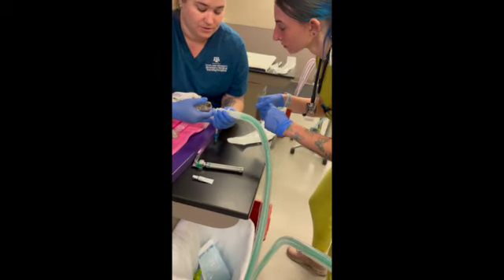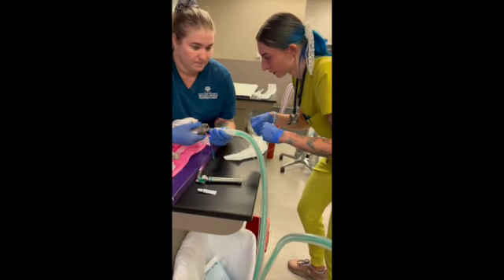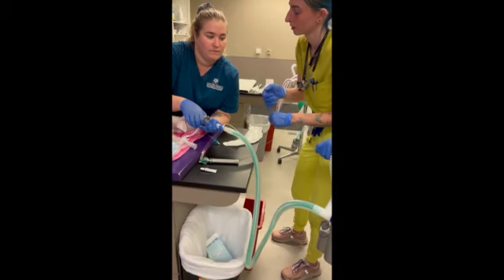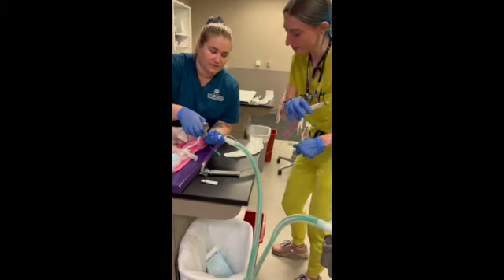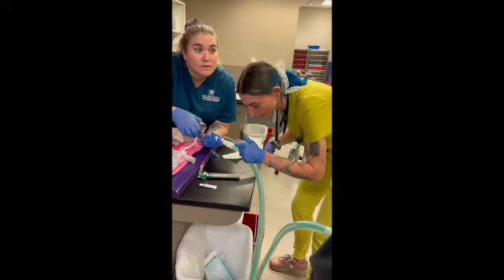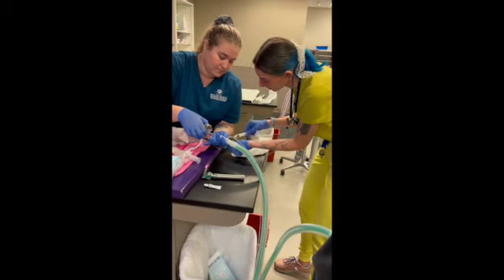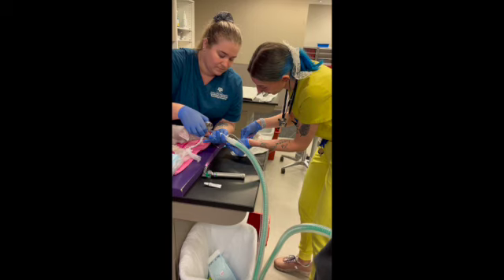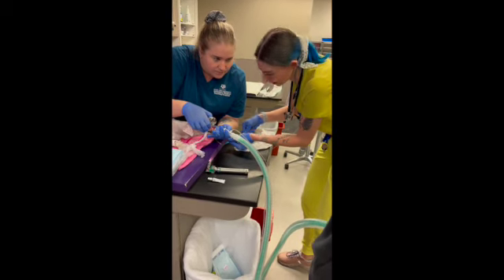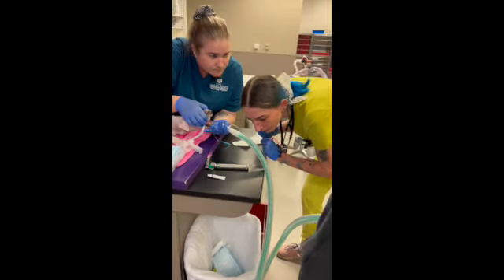We're going to turn on his oxygen as our first procedure. Okay. Alright, so we went ahead and connected his oxygen. You want to give him a breath? So now we're going to take our cuff and we're going to listen. So it definitely sounds like there's some leaks, so we're going to insert some air into the cuff. I think 2 mils is good. It sounded like a large leak. We added about 2 mils, so we're going to check again.